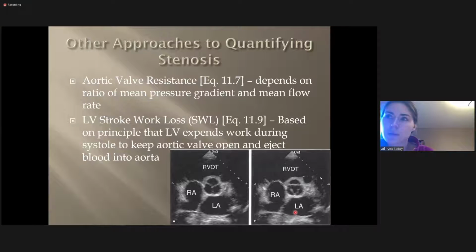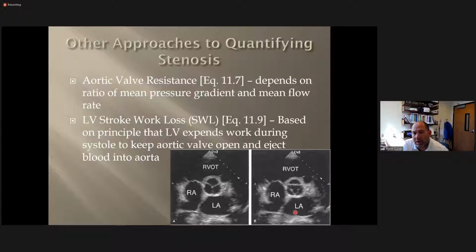Scott, you said we do tracing, is it in a pulse wave? Right, you're going to trace the VTI in pulse wave for the LVOT. And if it is stenotic, you're also going to trace the CW through the valve. We only take a peak velocity as we're screening people because tracing takes time. You've all done VTIs. It can be difficult sometimes to stay accurate, but the biggest thing is it takes a lot of time. So we just do a screening.